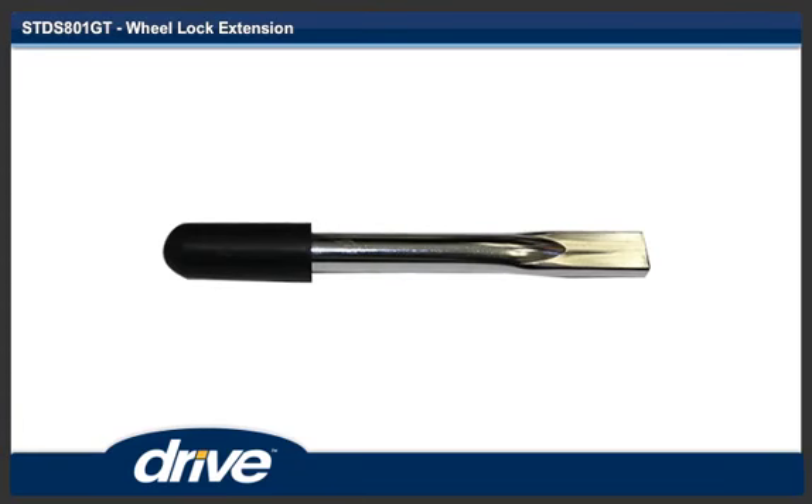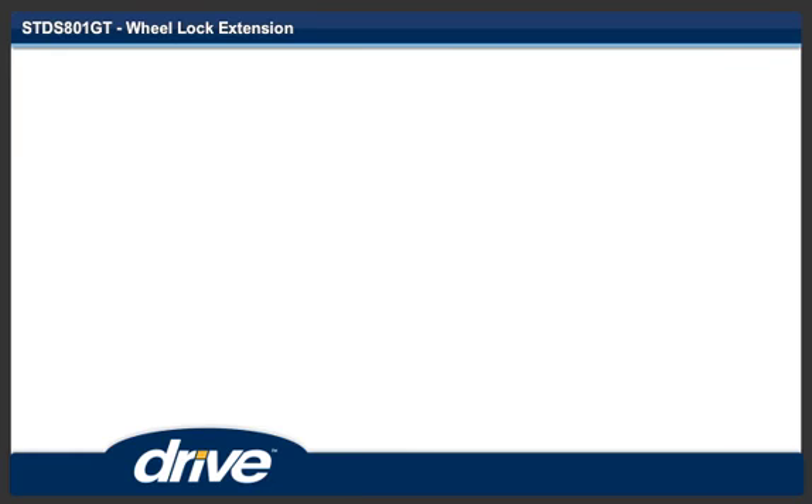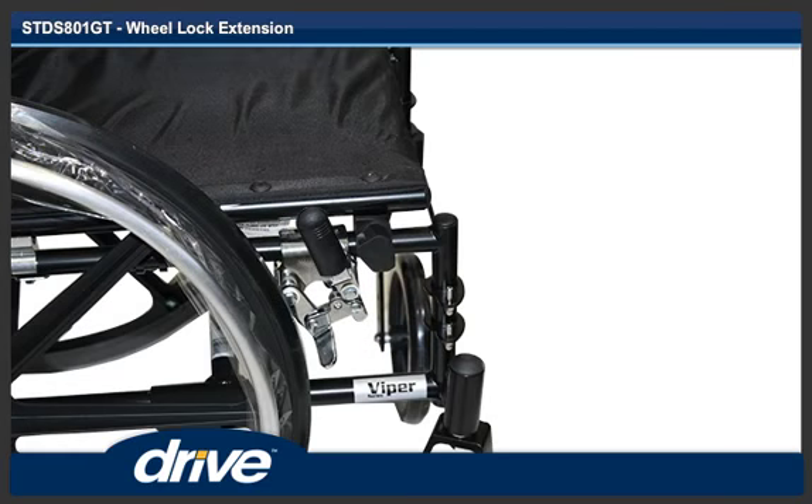Step 1. Remove any wrapping from the wheel lock extension. Step 2. Remove the wheel lock tip from the wheel lock on the chair.